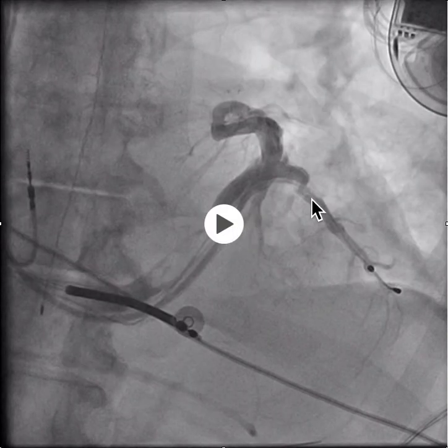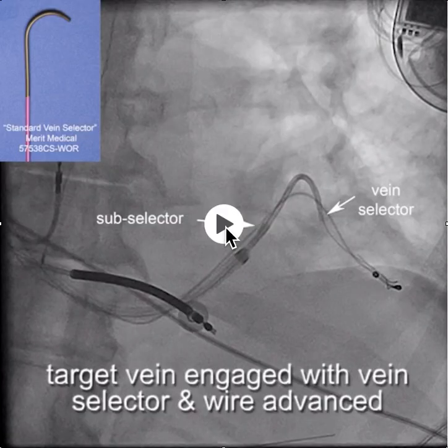You can see the anatomy here — a tortuous segment, with another lead already in place. Adding a lead to this same vein could be potentially very difficult, and there was no other vein to go to.